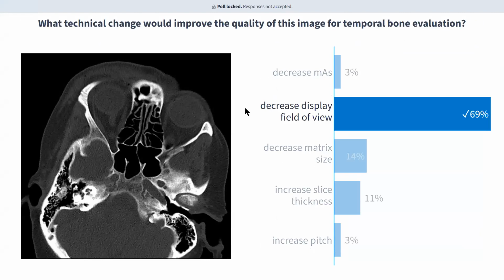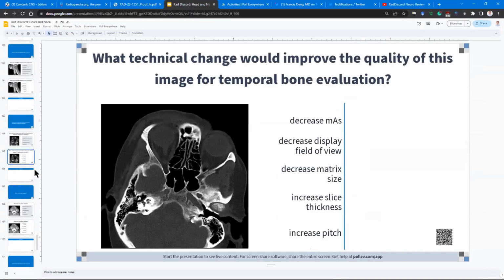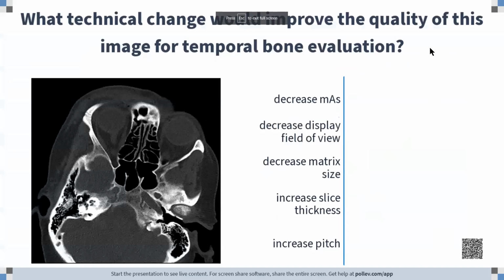Okay, this is a decreased display field of view. Okay, so let me pause here for a second and see how many additional cases I have left. It's not that many. 1, 2, 3, 4. 4 cases left. All right. So the answer was decreased display field of view.